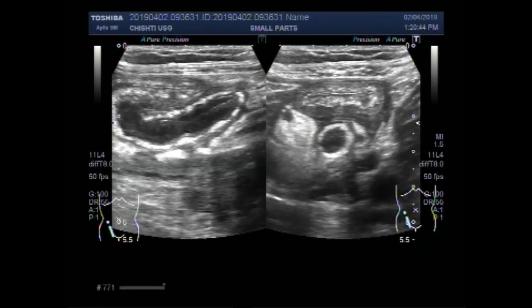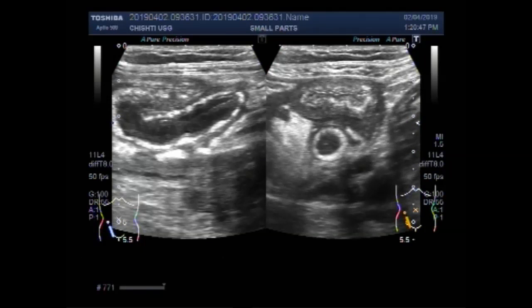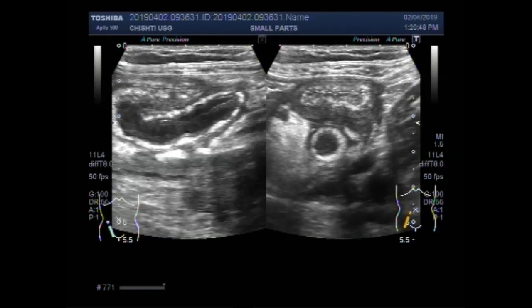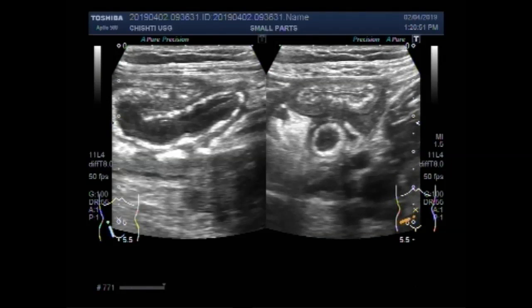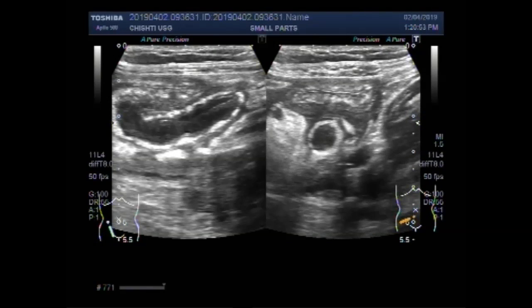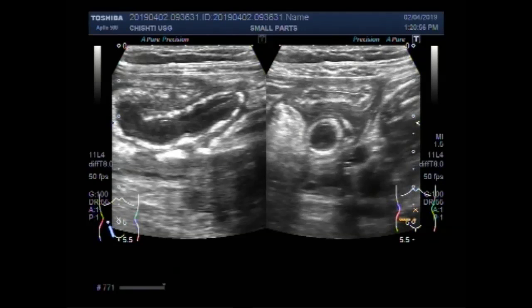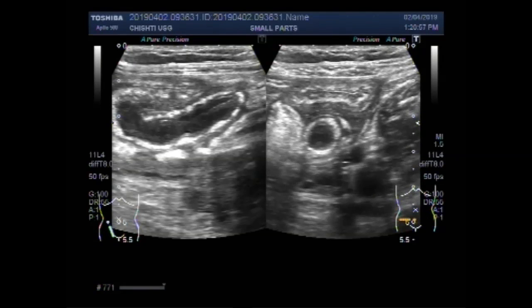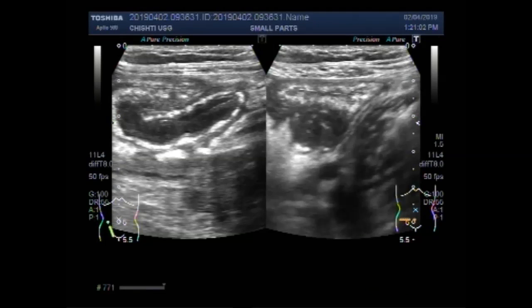Again you can see, by moving and sweeping the probe, this vertical or longitudinal view of the inflamed appendix.